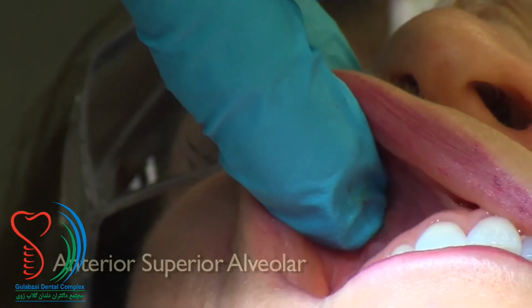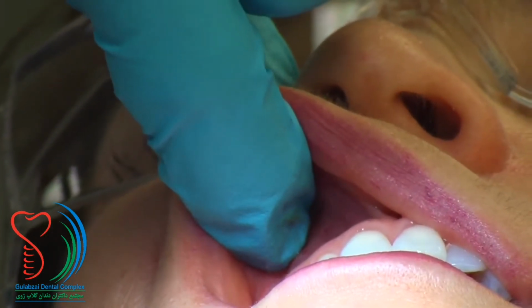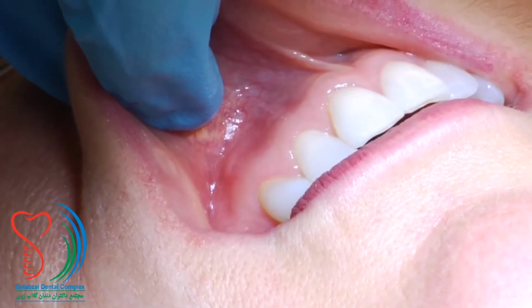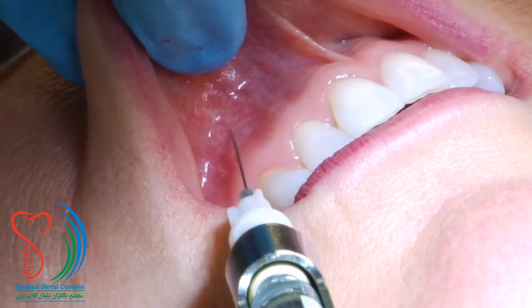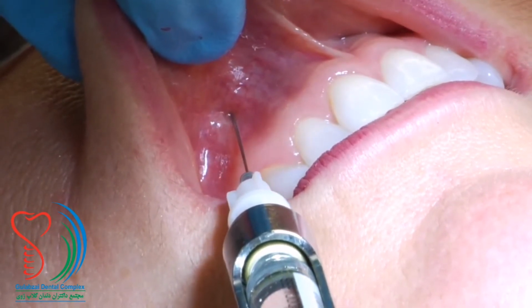With your non-dominant hand, press the thumb downward near the nose to create some distraction while the lip is being gently pinched. The insertion point is into the vestibular area at the height of the mucobuccal fold, just mesial to the canine and advancing to the apex of the canine.